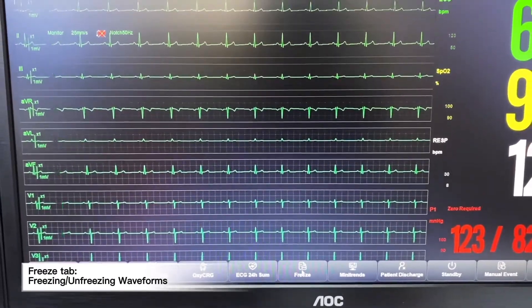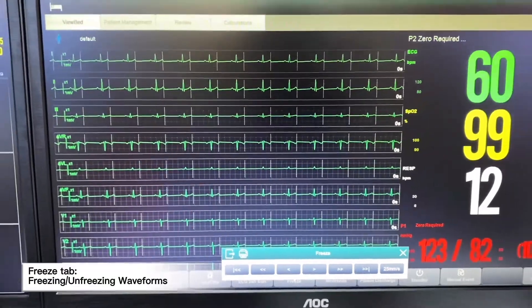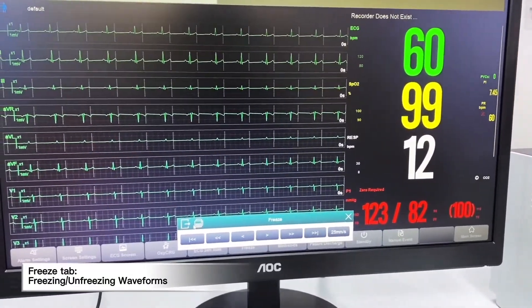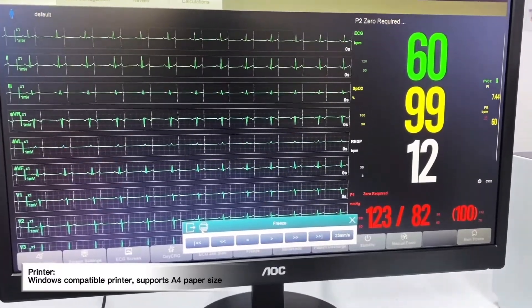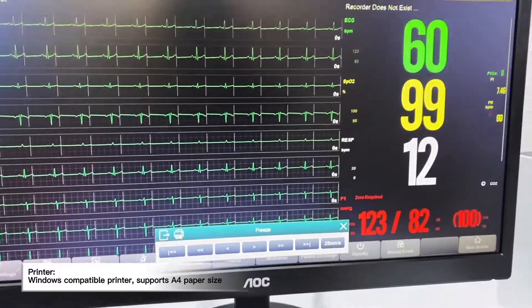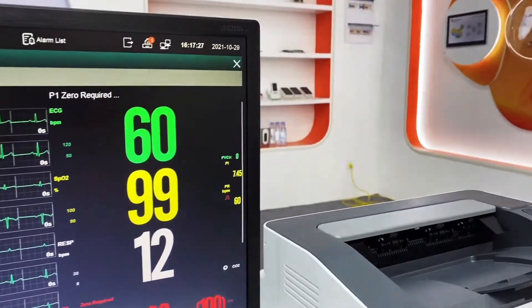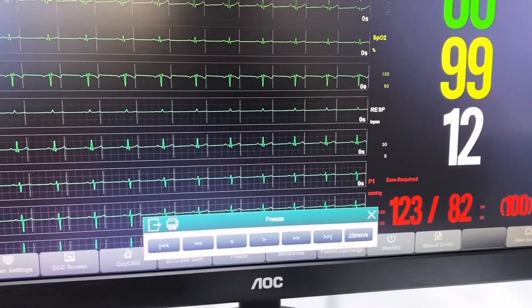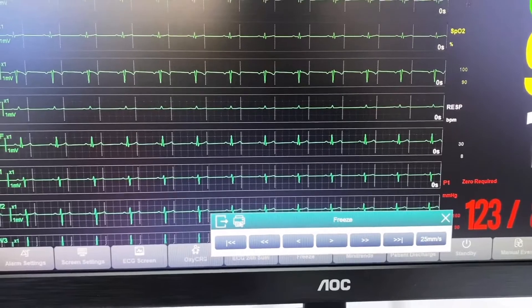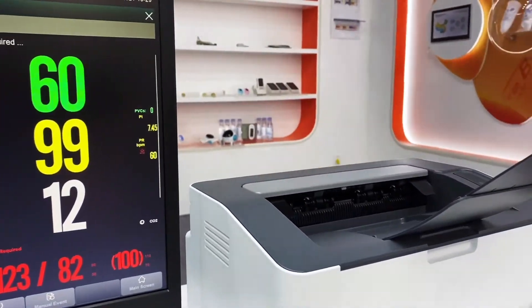We will be able to print out data if we have a printer connected to the CMS. Once we click print, the printer will print out the trend.